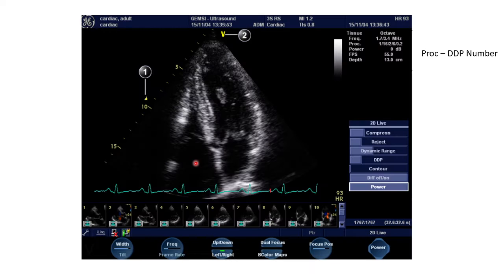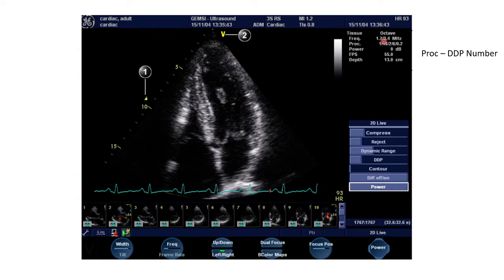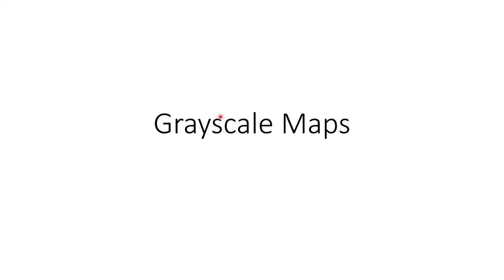Coming to optimization of 2D echo images. This is the screen which we get when we turn on the 2D echo. All these were explained earlier. This is the soft menu analysis, and we'll go into all these functions in detail.